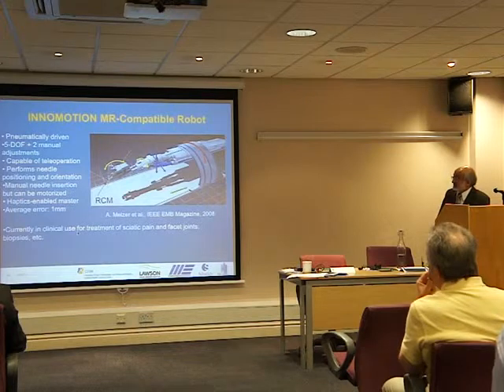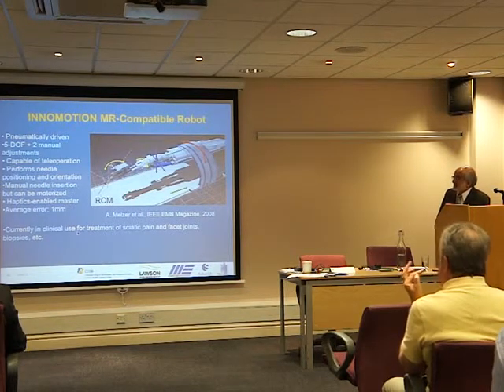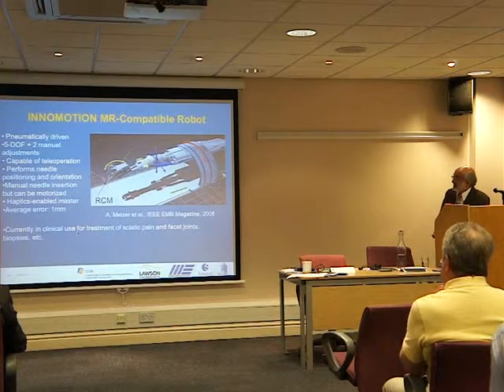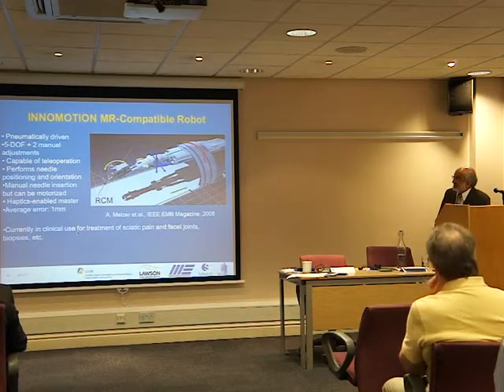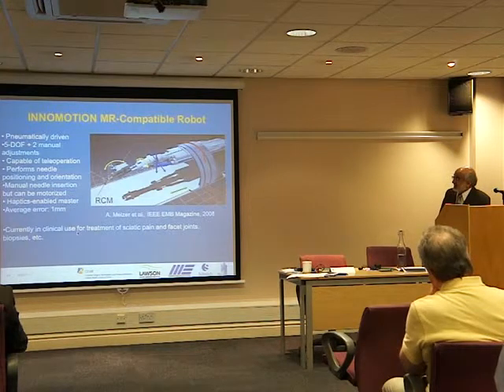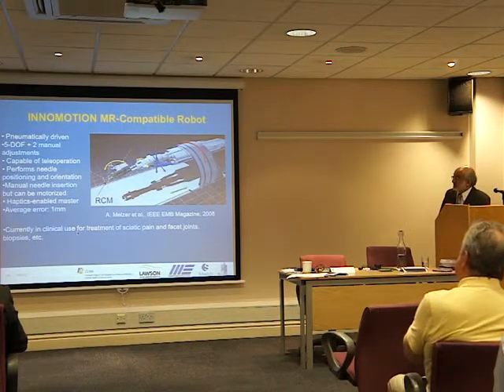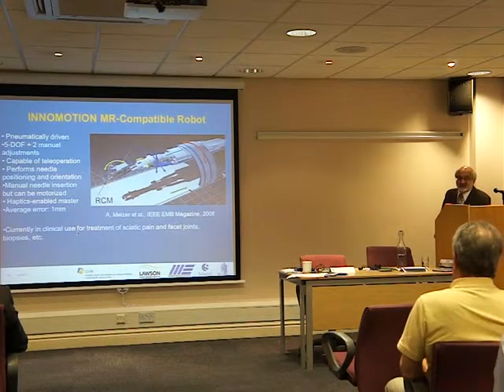This is a company in Germany that has developed a robot which is based on an earlier design from the group in Austria. I haven't seen any clinical work reported for brachytherapy, because this was actually designed for percutaneous treatment of pain. But more recently, they have been talking about trying to use this for brachytherapy.